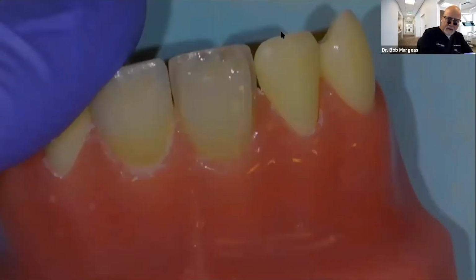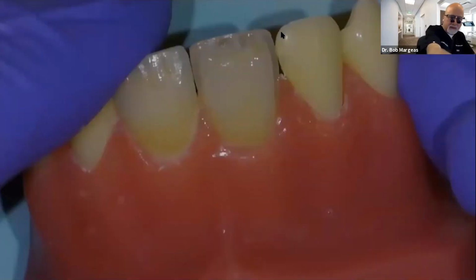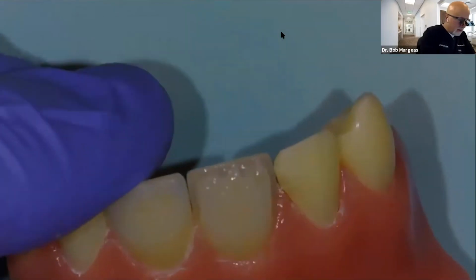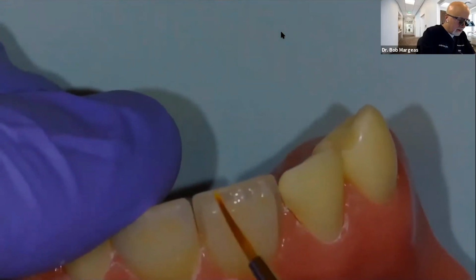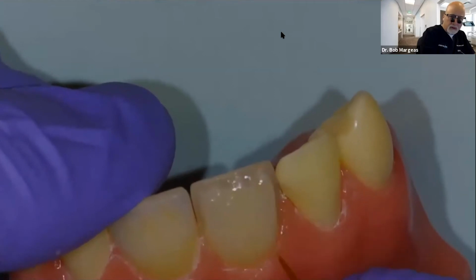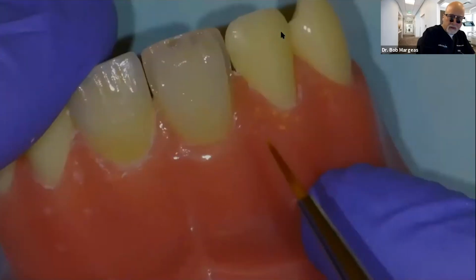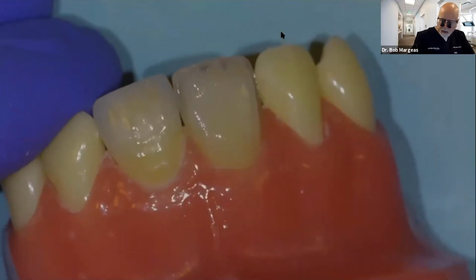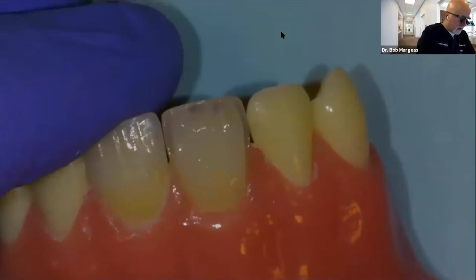And then I want to drag this toward those lobes like this with a light brushing stroke. You can see it over here, a little bit of white there. So I want to try to copy what I see.